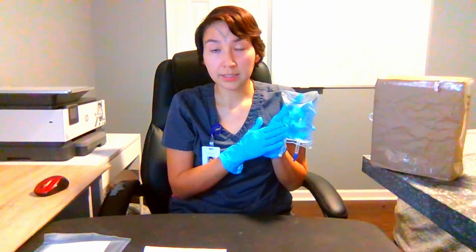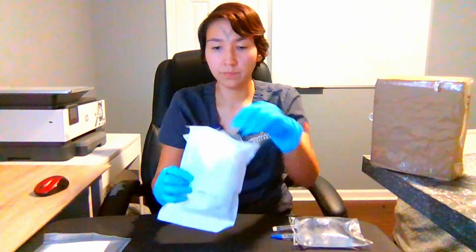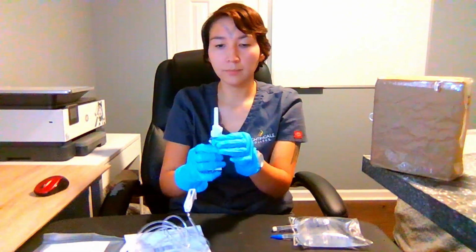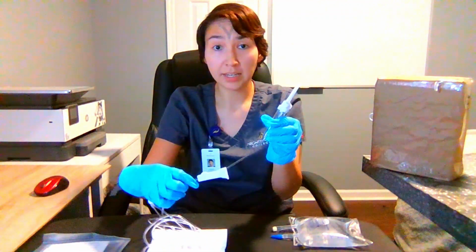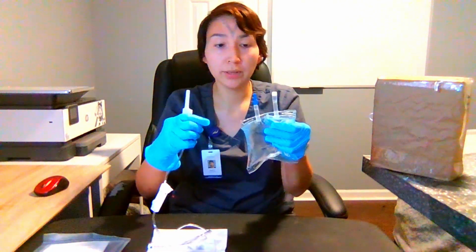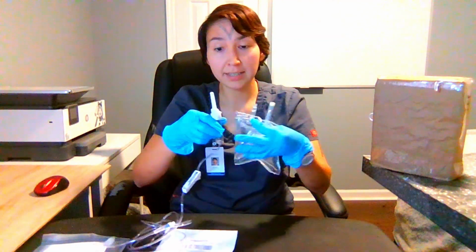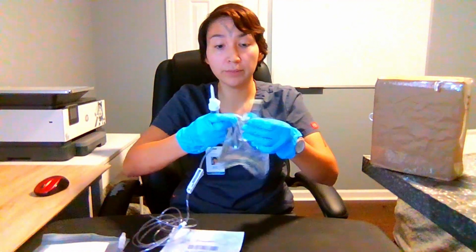I have confirmed that this is the IV solution the patient will be receiving. I'll make sure that the roller clamp is fully closed to prevent any fluid flow. I'll remove the fluid container port cap and the spike end cap and insert the spike end fully into the port.